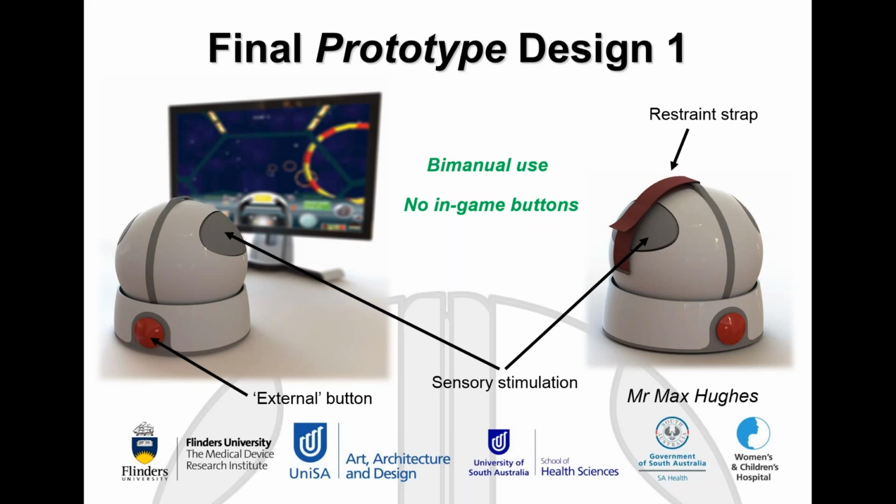And that was very important because we were trying to reinforce haptic or vibration feedback on their hands, because if you remember right back to the slide I talked about with cerebral palsy, we know that most children actually have an impaired sensory function. So we're trying to send afferent stimulation to this hand, which is more involved, the hand which does not sense touch in the same way that a typically developing child's hand does. So from a first prototype perspective, we ticked a lot of boxes with this particular controller.